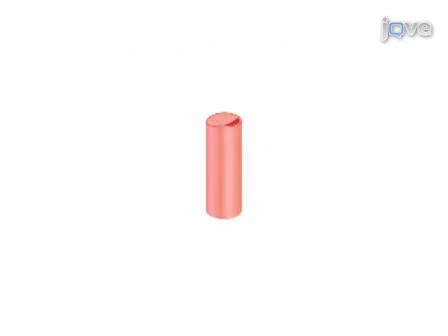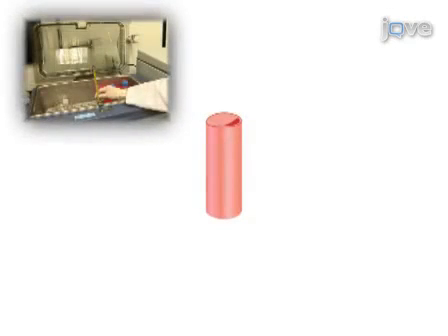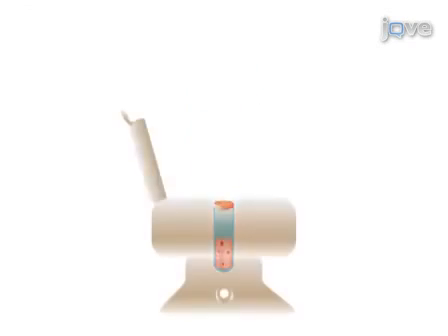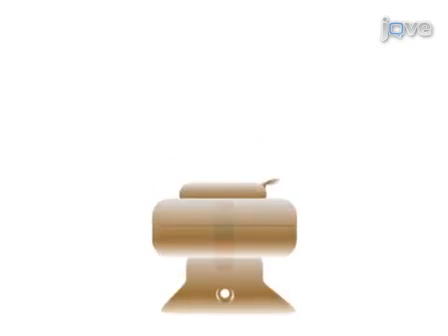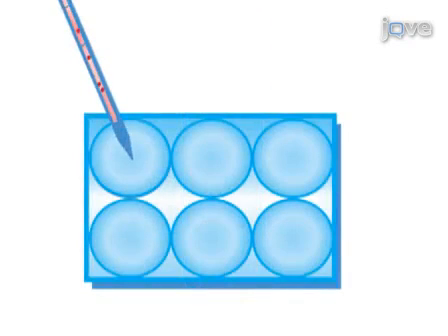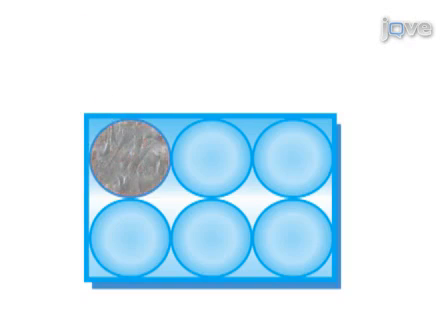To thaw human embryonic stem cells, a cryovial is removed from liquid nitrogen and quickly thawed in a 37 degrees Celsius water bath. The cell suspension is transferred from the cryovial to a conical tube, diluted with human ES cell culture medium, and centrifuged to form a small cell pellet. The supernatant is then removed, and the cell pellet is resuspended with fresh human ES cell culture medium in the tube before plating on one well of a 6-well cell culture plate previously plated with an irradiated MEF feeder layer.